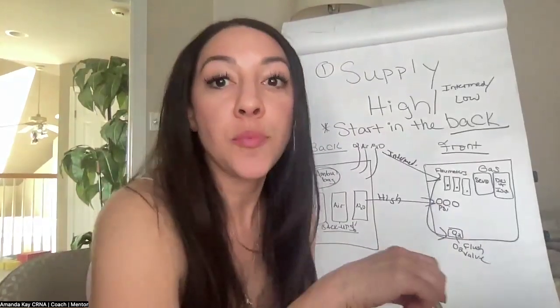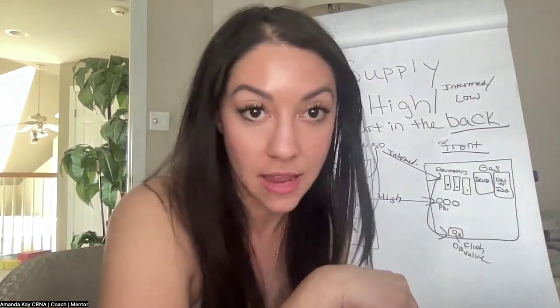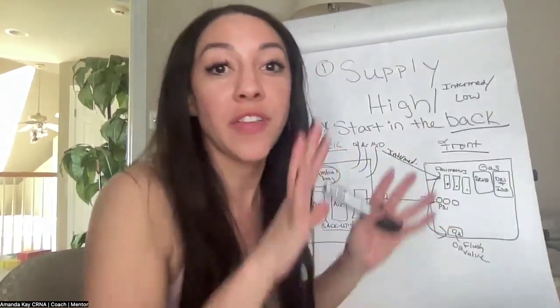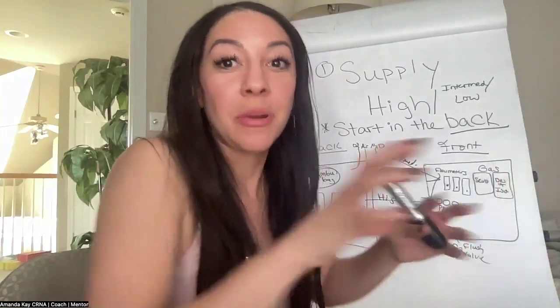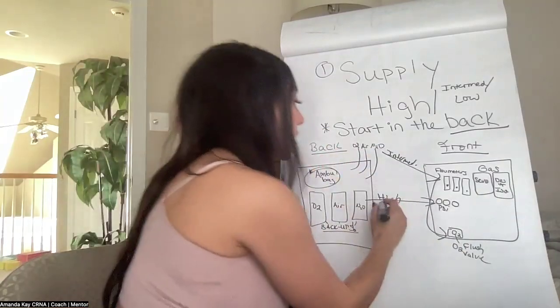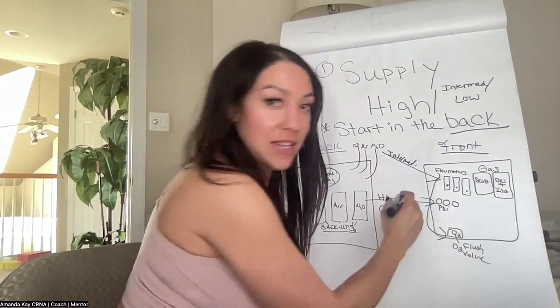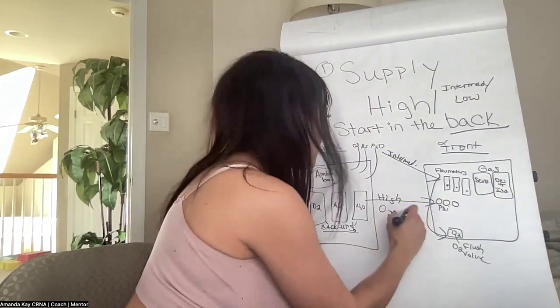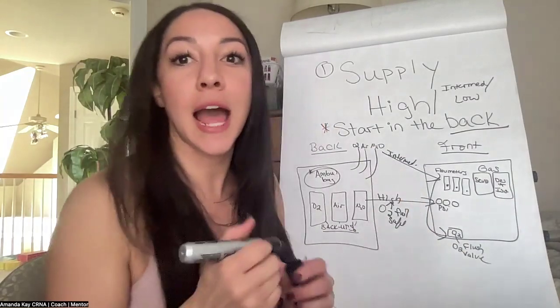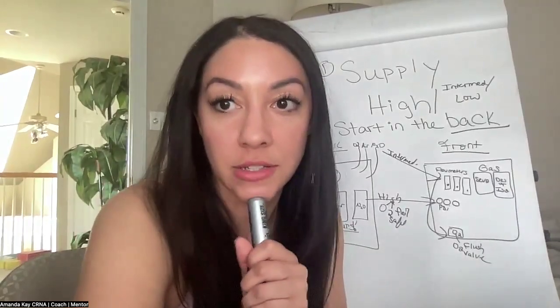And then the low pressure, there's a low pressure oxygen alarm. It's called the oxygen fail-safe. The oxygen fail-safe is part of the high pressure system, but it's a low pressure oxygen alarm. So put this over here with high. I had to review all this stuff, guys. So your oxygen fail-safe is part of your high pressure system, but it basically goes off when there is a low pressure of oxygen.